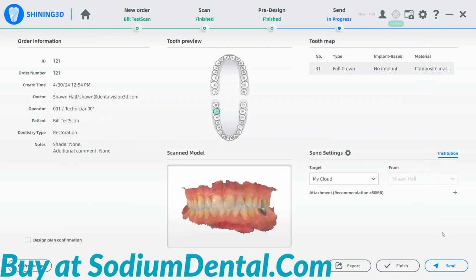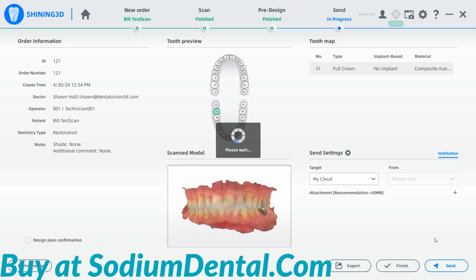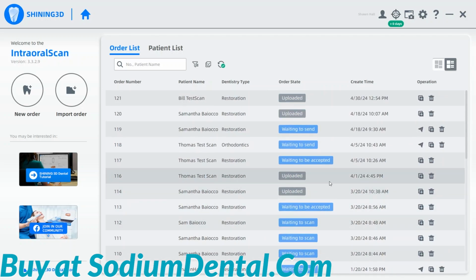If they did join the free cloud, you simply select them and then hit send. And all will be done. It'll be sent off to the cloud, and from there they can accept the case, they can download all the digital impressions they need, as well as see any notes or attachments that you put onto the scan. Also then, from your homepage, you will see things that are sending, uploaded. They will move from uploaded to accepted once the lab accepts them.